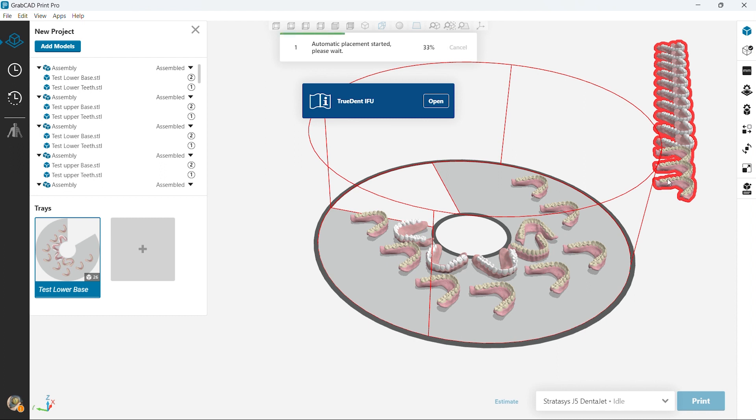Again these are all the same cases duplicated, but in a real-world scenario you'd have all your different cases lined up on the printer.